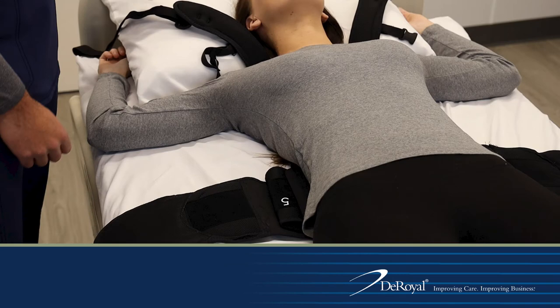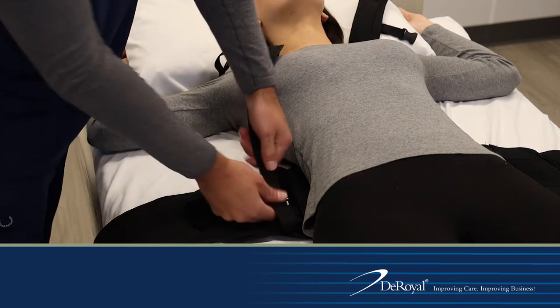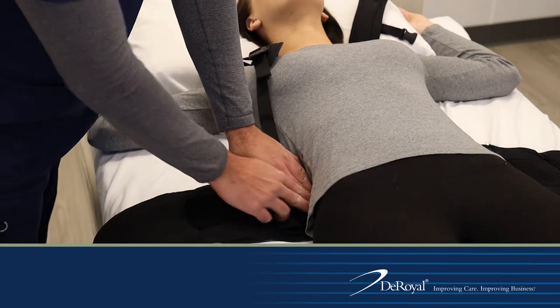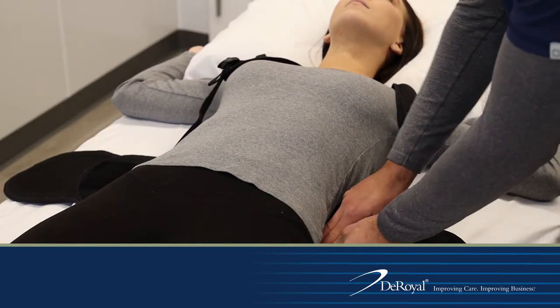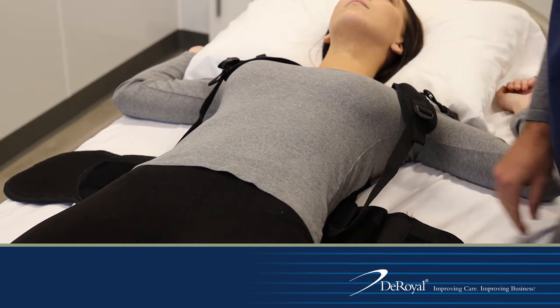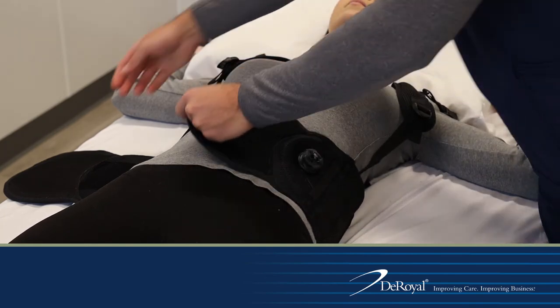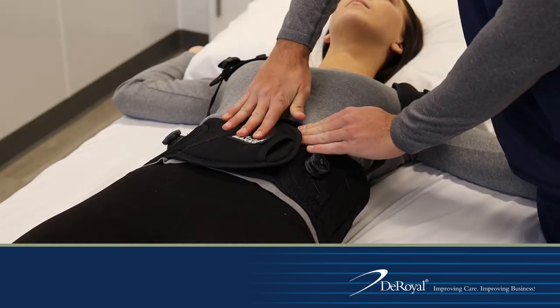With the brace under the patient in supine position, place the DLE straps above the patient's head. Bring each strap down and anchor it to the posterior panel. The straps can be anchored in each of the three zones labeled A, B, or C in the posterior panel to achieve varying degrees of lordotic immobilization. After the DLE straps are anchored, wrap the brace belt around the patient and secure the anterior panels.